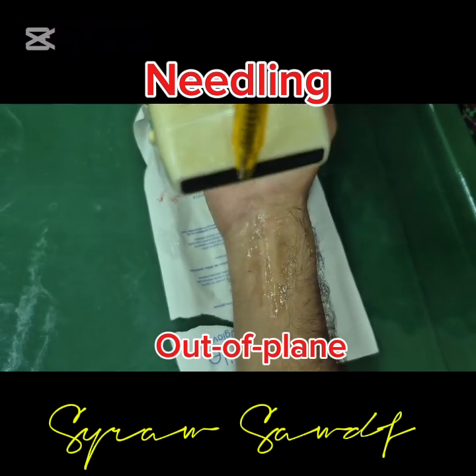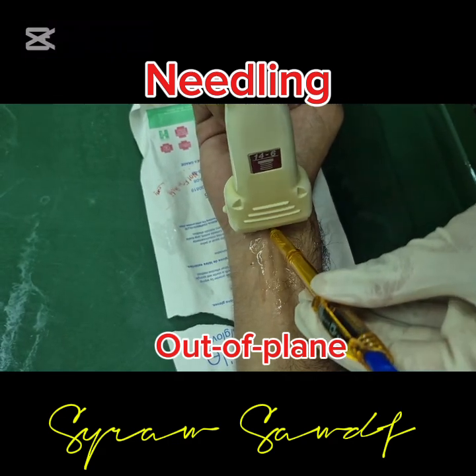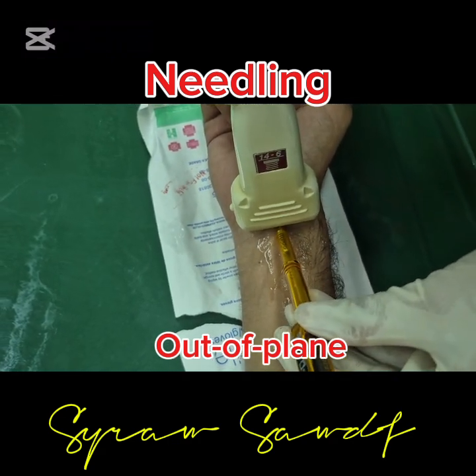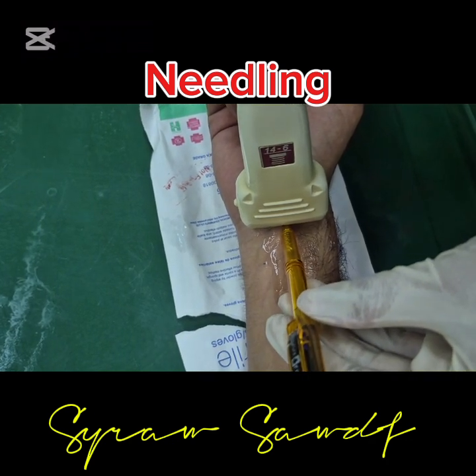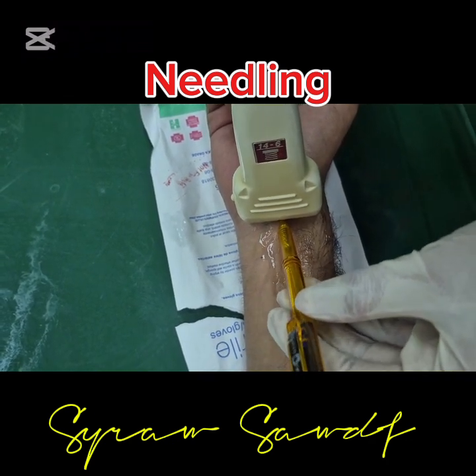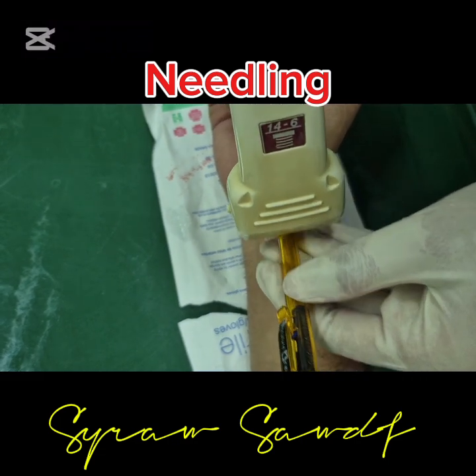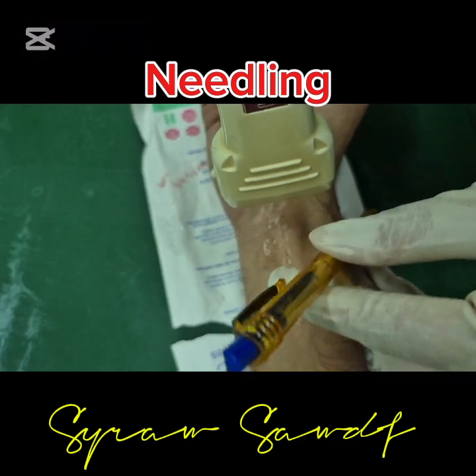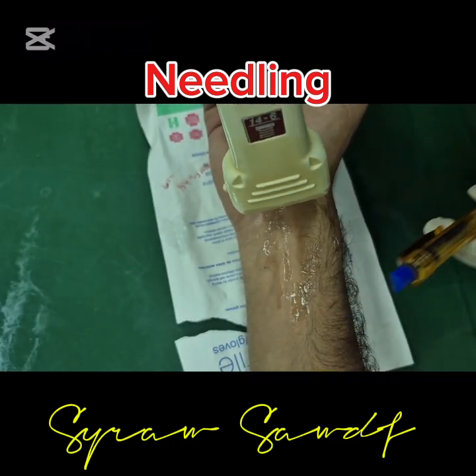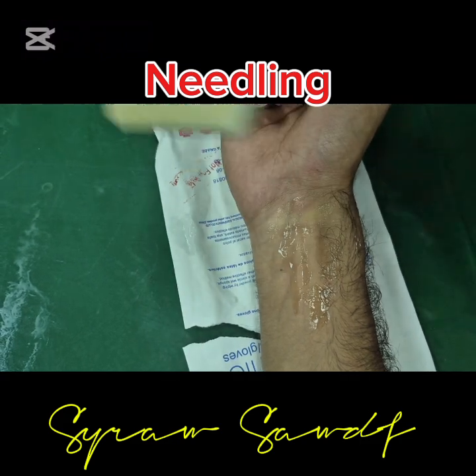So this is the out of plane technique, like this. While using this technique, you will be able to see just part of the needle, sometimes the tip and sometimes part of the shaft that is passing under your probe, not the whole length of the needle. So it appears as a dot on the screen. So that is in plane and out of plane techniques.